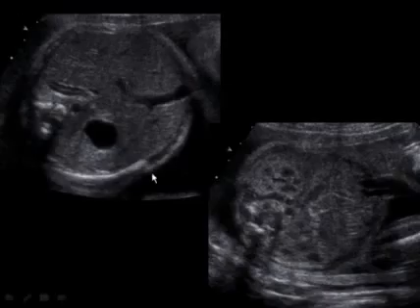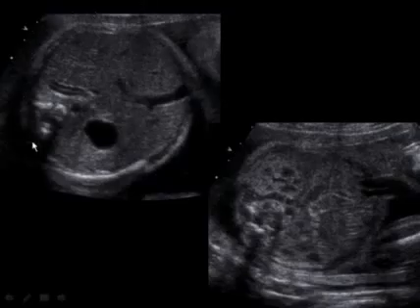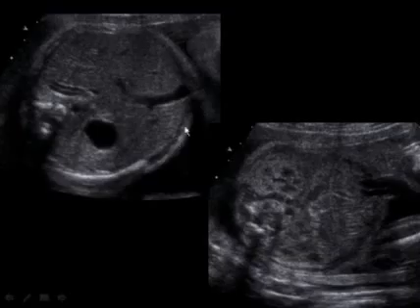So here's an example of pseudoascites. We have a transverse view of the abdomen here, and there's this hypoechoic rim seen along the edge of the anterior abdominal wall, but notice that this is the musculature that extends from the edge of the rib and is not intraperitoneal, and when we go down to the pelvis, we can see that there's absolutely no fluid down near the bladder or around the kidneys, and there was no ascites in this fetus.